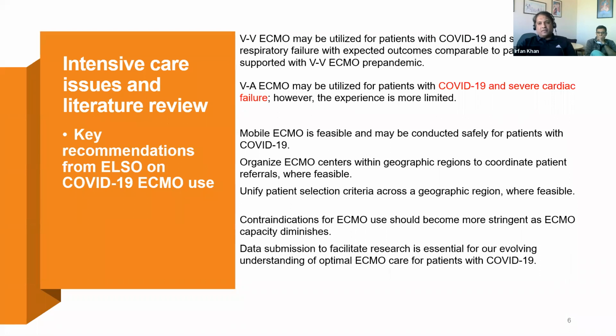Mobile ECMO is feasible. You have to organize ECMO centers within a certain geographic region, so you're talking to each other, you're communicating, you're basically setting similar criteria for offering ECMO so it doesn't become confusing. That's something that is being encouraged. Obviously, as capacity diminishes, you have to make sure that the contraindications are taken care of and you're not offering ECMO to patients who don't need it. Data submission is key because we all have to learn from it and do a better job.